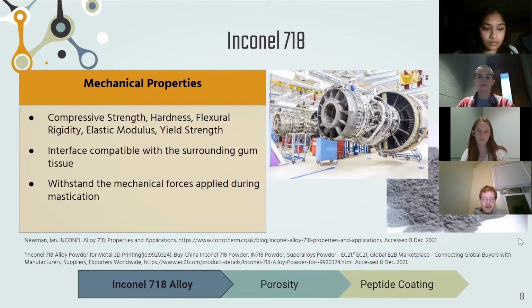Wear of metal implants is a major concern, as degradation of the implant can lead to corrosion and increased risk of screw dislocation. Increased flexural rigidity of the device will reduce the bending of the screw, which is a major factor in screw dislocation and integration with the alveolar bone.